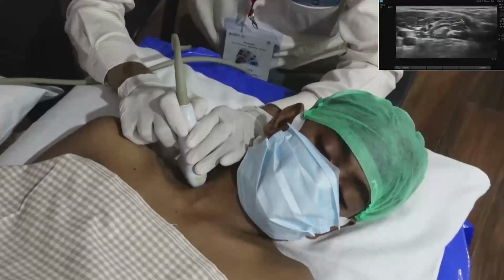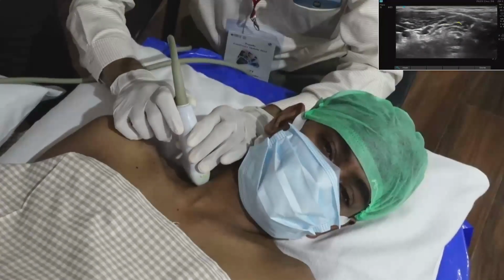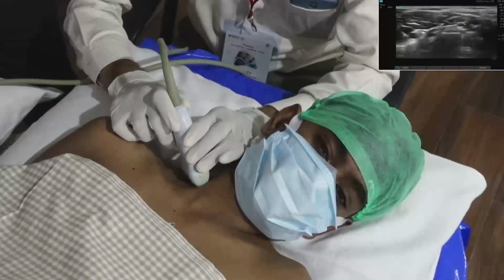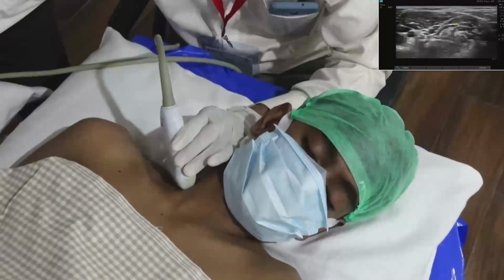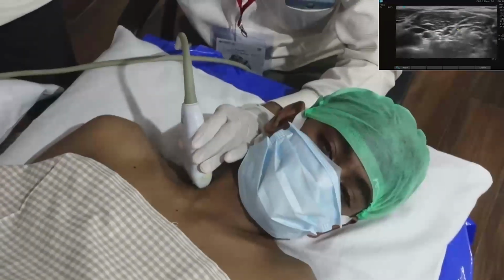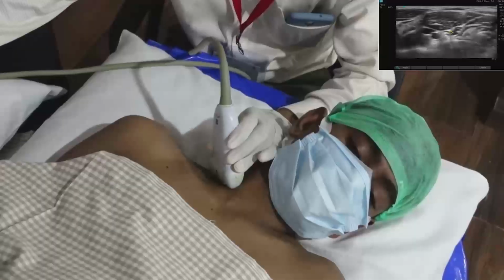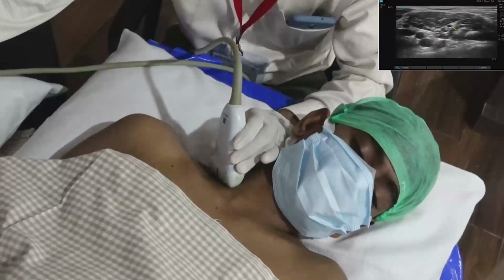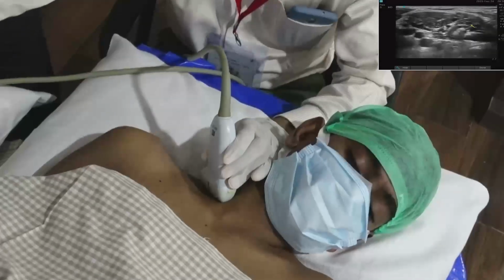There are some hyperechoic areas seen in the middle scalene, probably one above and one below. Two lines are there. These two lines, if you trace, they are coming and going in from the interscalene groove and coming out. They are the elements of the dorsal scapular nerve and long thoracic nerve.